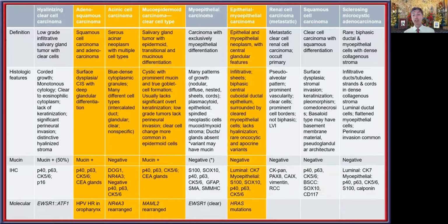They may form these very nice bands, and the bands will then separate out into an individual single cell or cord-like appearance to the neoplastic proliferation that can be seen in this case here. So when I think about this tumor, there's usually some sort of arc of changes that you can see in the tumor, with an area like this appearing much more squamous, where there's an opacification of the cytoplasm, prominent intercellular borders, and perhaps even some intercellular bridges.